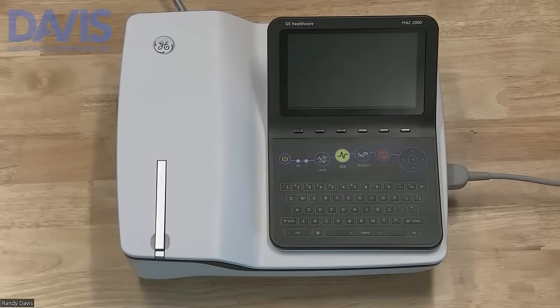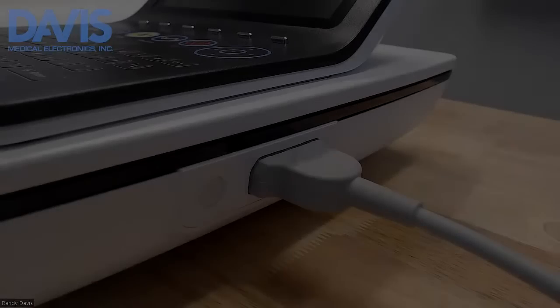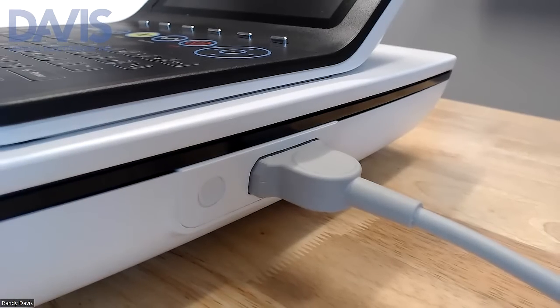This is a training video on how to use the GE Mac 2000. When setting up your unit, make sure that the patient cable is connected to the port on the right side.